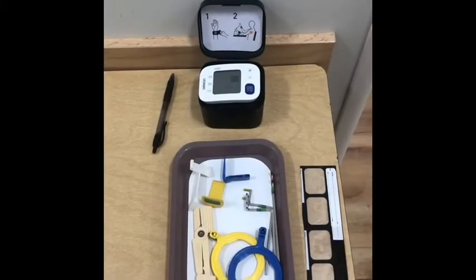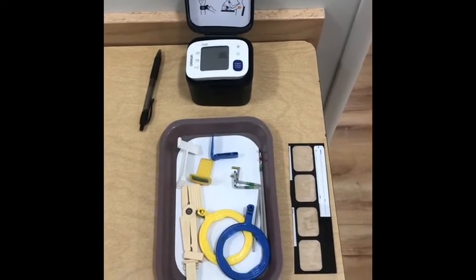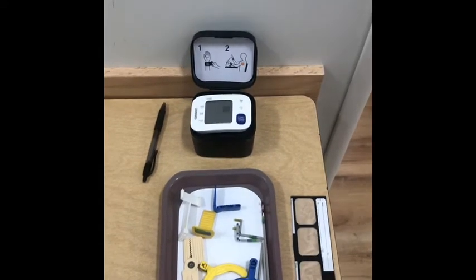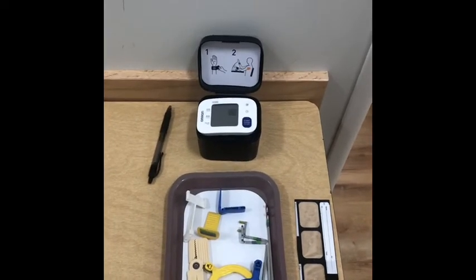Supplies to have out prior to bringing your patient back so that you are set up and ready to go would be a film mount, your tray with your XCP supplies. You would have your film as well, and then a pen to make any notes in the chart or to document the blood pressure, which is with that automated wrist cuff there.